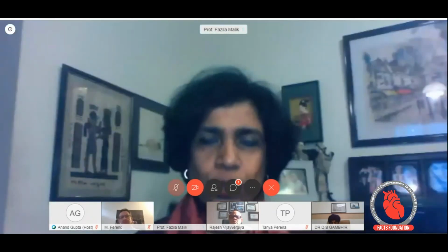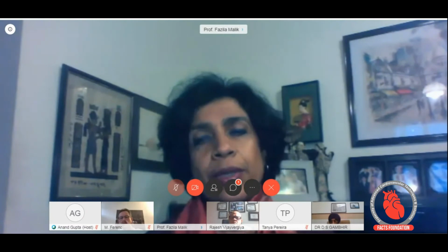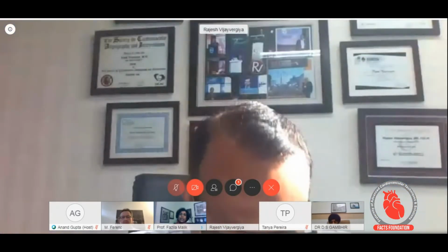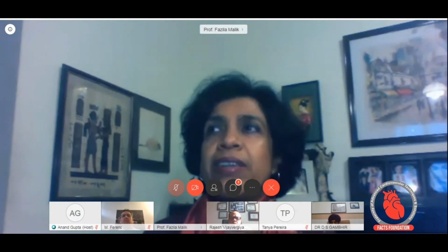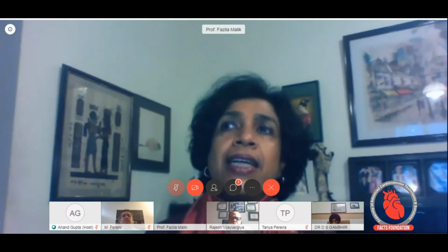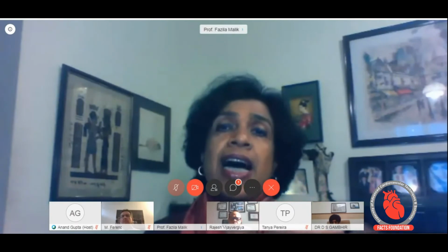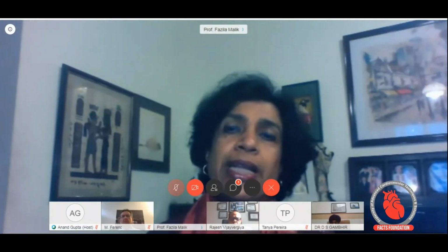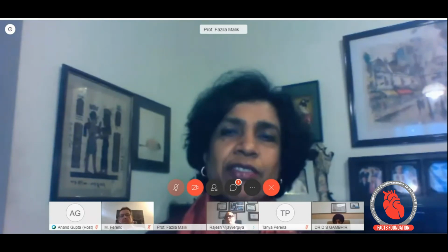Well, yes, we do use a lot of Resolute Onyx, and we talked about it in the summary. Nowadays, lots of stents do have these qualities, but the Resolute design allows you great side branch accessibility, and that I feel is one of the greatest benefits when you use a Resolute Onyx in a bifurcation situation like a left main. And it has a 5 millimeter size. In 75% of cases, we know the left main is larger than 4 millimeters, and Resolute Onyx comes in 5 millimeter size. So proper sizing of a large left main can be done only with a Resolute Onyx, and it has great radial strength, which helps in the left main situation.